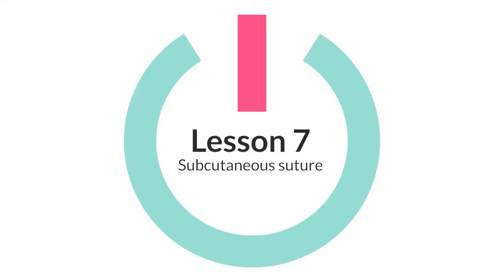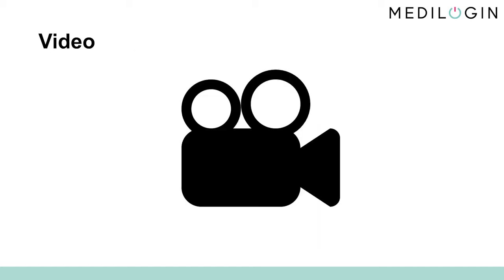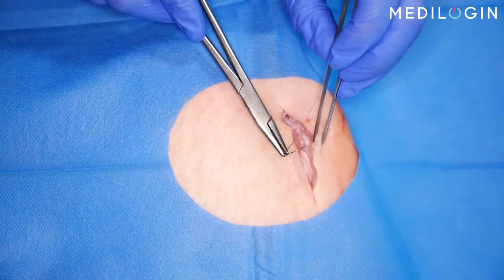Here you can see a wound defect that extends into the subcutis. The suture is performed in the subcutis with a complete 360-degree rotation of the needle. It connects the subcutis on both sides, taking the deepest point of the wound with it. The actual skin suture can now be undertaken. As the knot is also subcutaneous, it is imperative to use resorbable material. Let's have a look at the subcutaneous suture in a video.